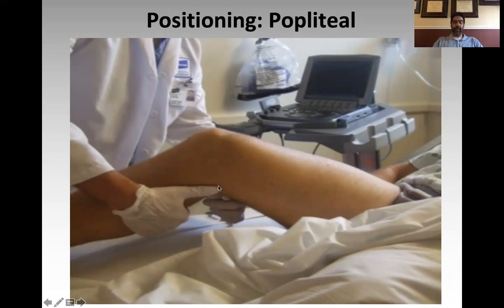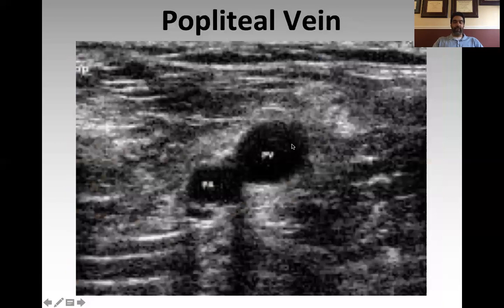But you're going right in the middle of the popliteal fossa, dot pointing to the patient's right, looking for the popliteal vein and artery. The anatomy down here becomes a little bit more variable than it is up in the thigh. So sometimes you will see vein and artery right next to each other. Sometimes you'll see vein on top of artery, sometimes the other way around, but you're looking for two vessels, okay?